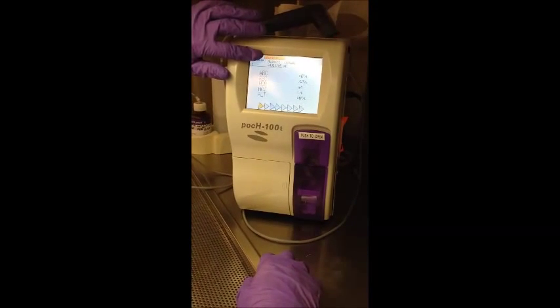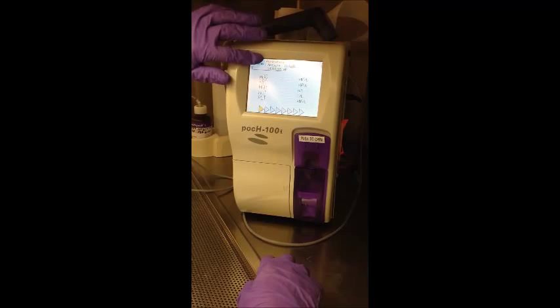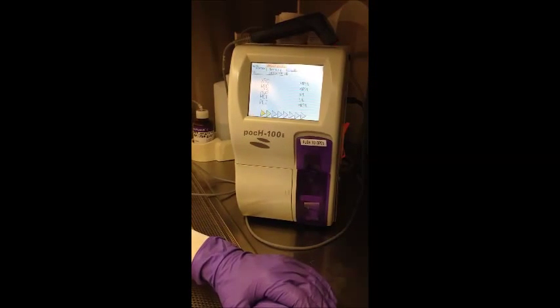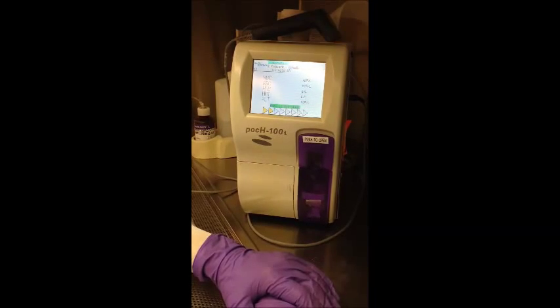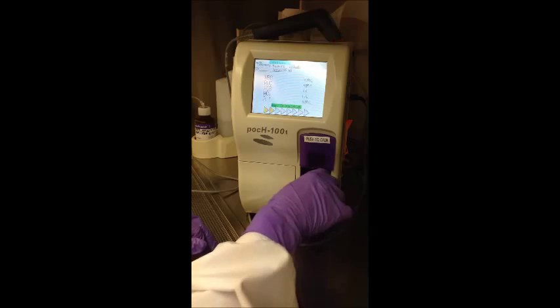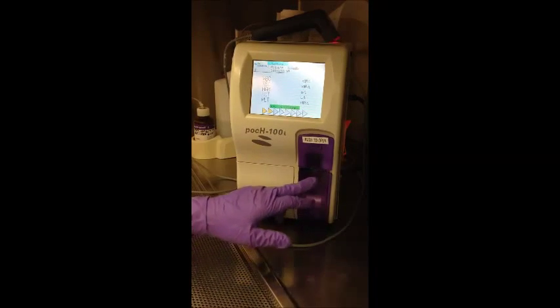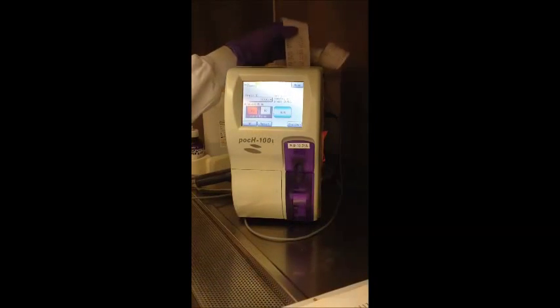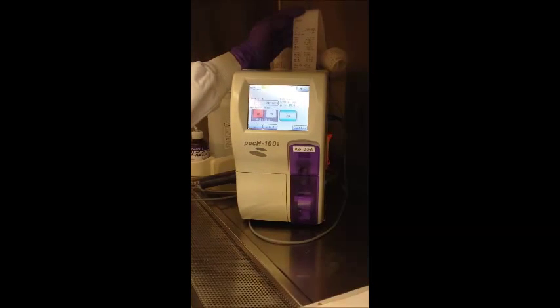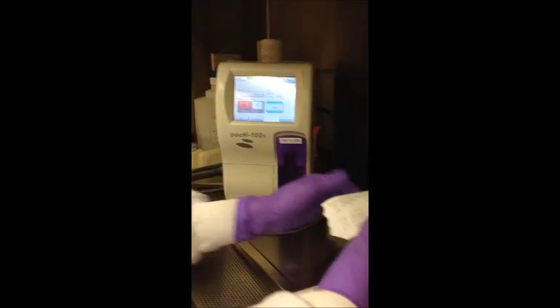Sample's aspirating right now. Once aspirate is finished, we can access the sample and remove it. The results of the analysis print automatically, and these can be used during the Ebola protocol.